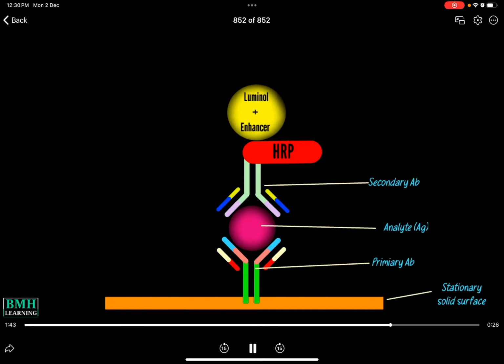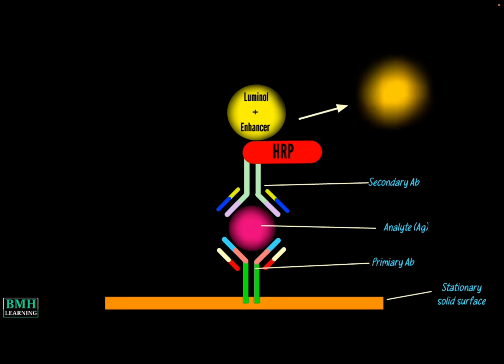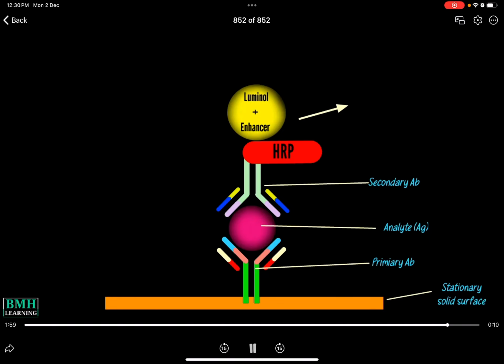Luminol as a luminescent substrate emits light by oxidation reduction reaction under the action of the enzyme labeled immune reactant and the luminescent reagent. The light intensity is directly proportional to the amount of labeled complex.